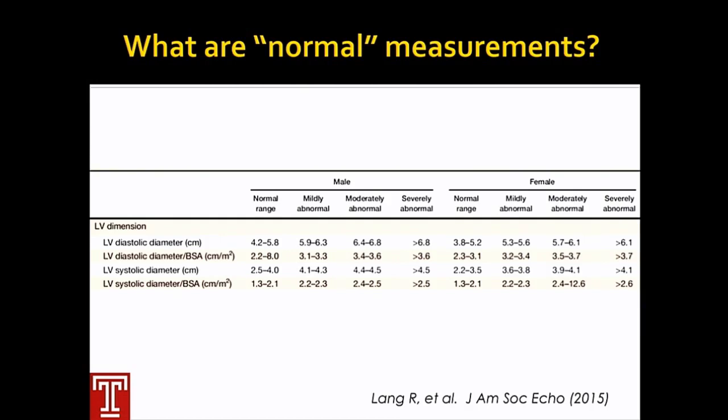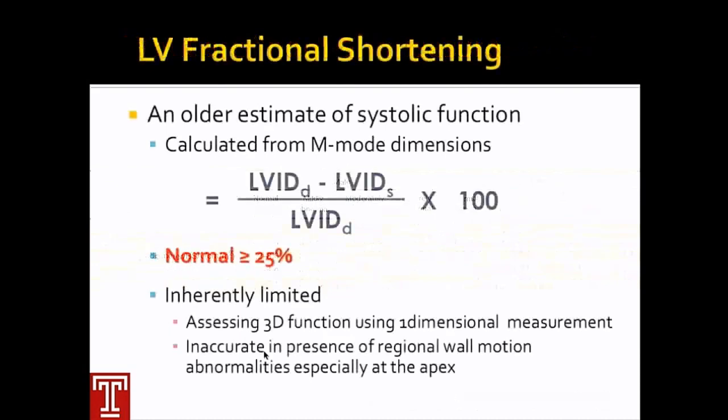I do put it in here for reference purposes, and Dr. Lang, I'm sure, will cover it in his next talk. So with these basically single plane dimensions, what can we do? Well, we can't do much with them other than say, well, it looks like the LV is dilated, or it looks like the LV is normal sized.